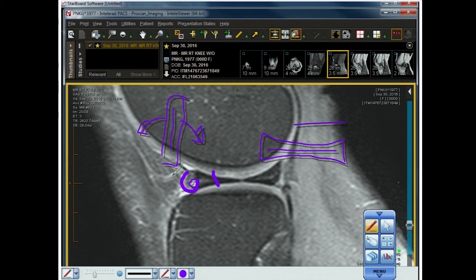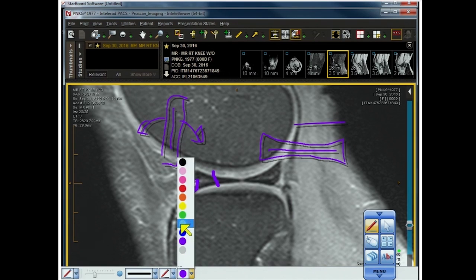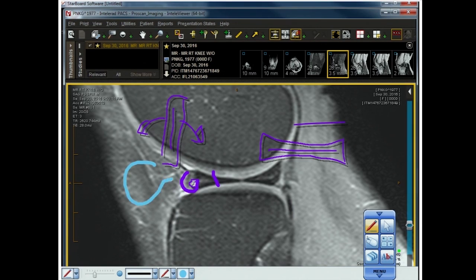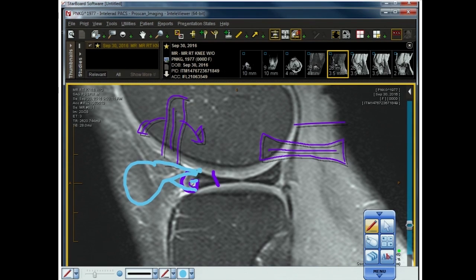If it's not a meniscal tear — like a ganglion — it'll make a big mass and the tail goes above the meniscus or below, but not in the center. So think of it like belly buttons: ganglia are outies — the tail goes above or below — whereas a meniscal pseudocyst is an innie, right in the center.